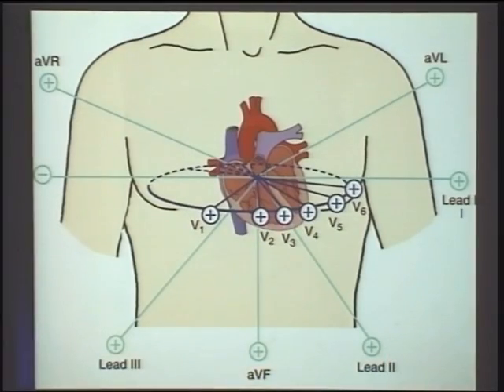Now what we are going to do is translate into coronary artery perfusion territories. So the next purpose I told you, what is the purpose of a lead system? To diagnose which coronary artery is diseased. So there are three coronary arteries: the RCA, right coronary artery, the left anterior descending artery and the left circumflex artery. Now we can see that.